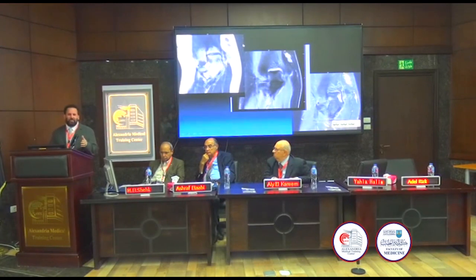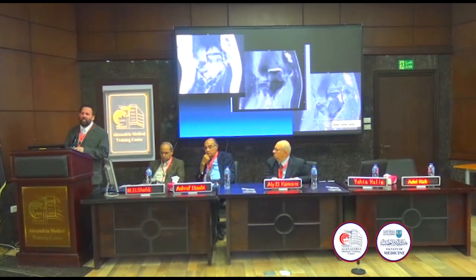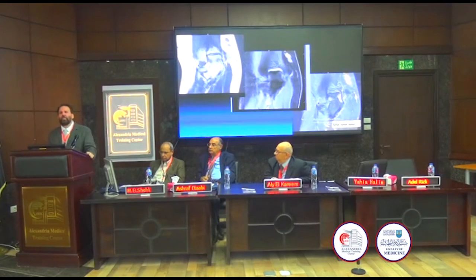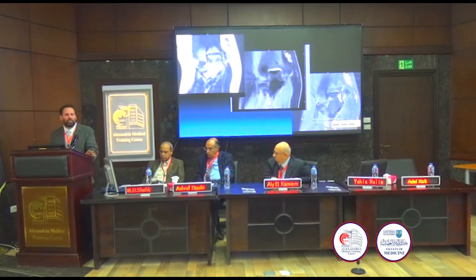So in the elbow, we talked about distinguishing internal derangements from external derangements. And we say the first thing to look for is joint fluid. Is that joint fluid clean, homogeneous, very bright on T2, less bright than muscle on T1, no visible synovium, bland effusion, cartilage loss, anterior capitellum, and radial head. Maybe an osteochondral defect, anterior capitellum. If there's no joint fluid, we think about external derangements. Flexors and extensors, epicondylitis, biceps and triceps. And remember, biceps, distal biceps, anabolic steroids, triceps, corticosteroids, lupus and other inflammatory arthropathies.